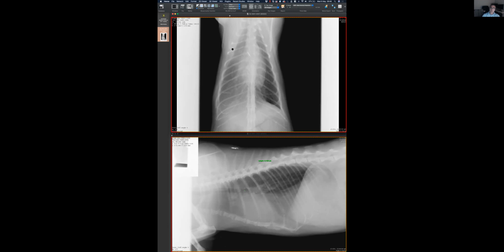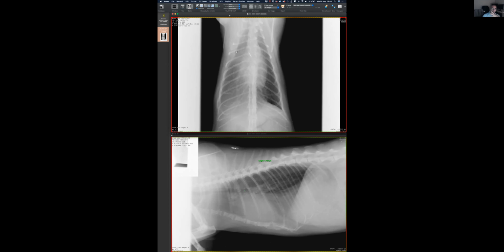You said somehow there is a contradiction here. You said the opacity of this looks like the wall, and I agree with you. And the way that I would argue that this is still fat is because it is thicker. Do you remember that we played with the thickness? So the opacity is not only related to the composition of the tissue, but it's also related to the thickness. And that is the reason why it looks wider compared to this. Makes sense? There is more, it's thicker, it goes along the wall.